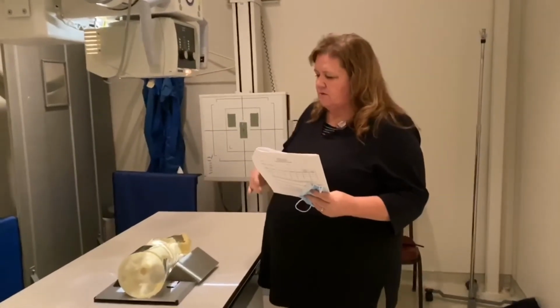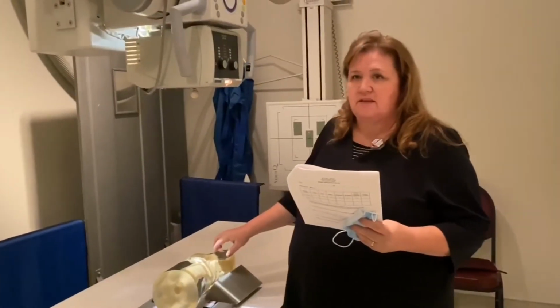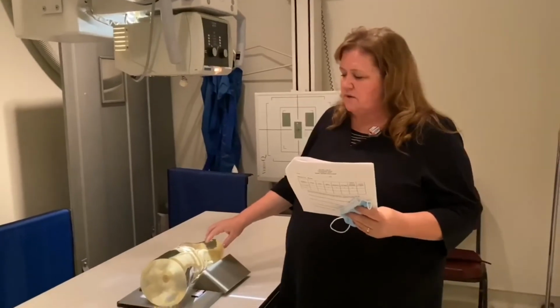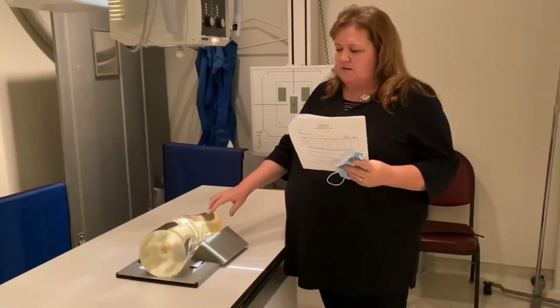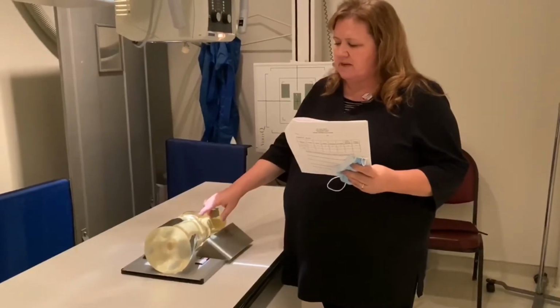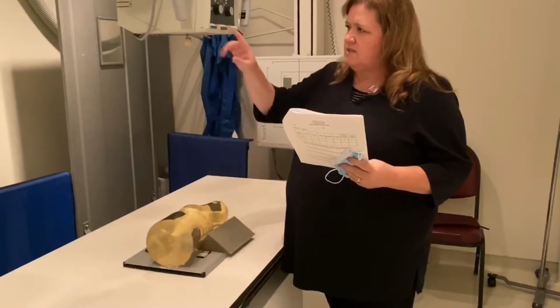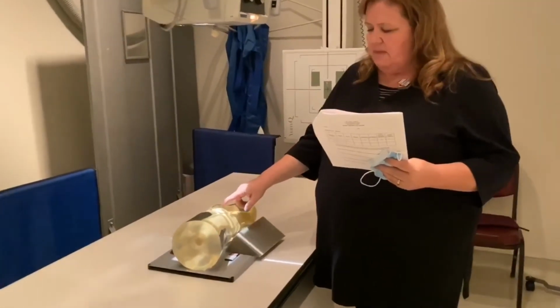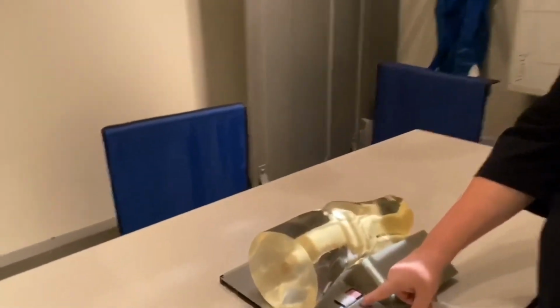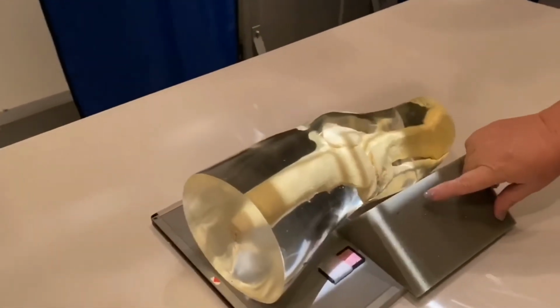All right, so in room 2, we're going to be doing the KVP and showing the effect that KVP has on scatter. We're going to use the knee phantom, 10 by 12, and we're going to do the collimation at 8 by 10, so we can see what it looks like on the outside. You're going to center, we don't have to have exact centering, just somewhere in the middle of where the patella is. Make sure that you include your marker on there.